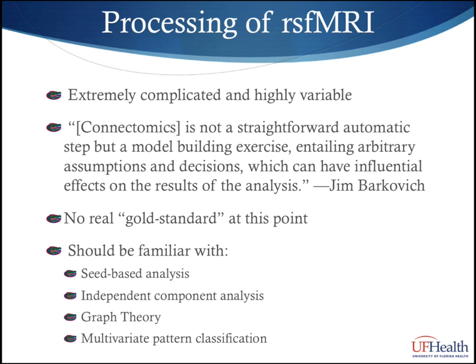A second methodology is independent component analysis, which is commonly abbreviated ICA. This is a computerized whole brain approach which maps all voxels in the brain to areas which have statistical similarity. This ideally will return data on all associated networks in the brain. The mathematics behind this are quite complicated and involve chaos theory mathematics. As such, the same data set processed 2 times may give slightly varying results.